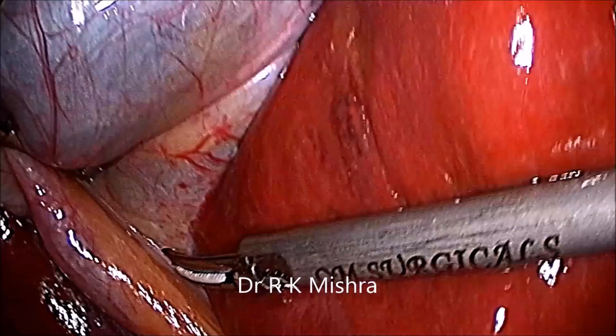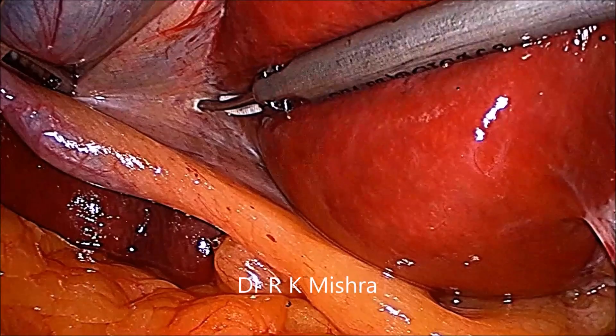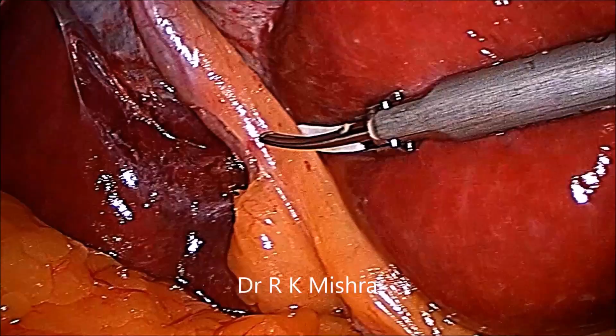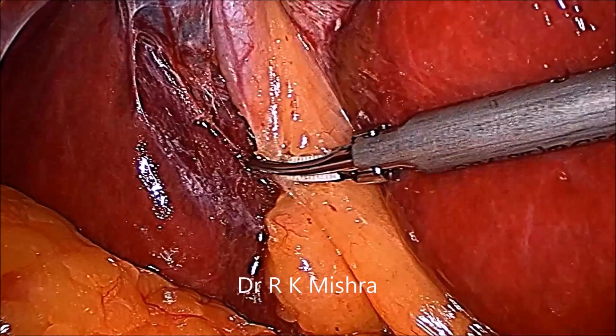Now you can give anterolateral traction to open the anterior peritoneum. Again, Rouviere's sulcus at the junction of the body of the gallbladder with the cystic pedicle. Now the cystic pedicle should be skeletonized.